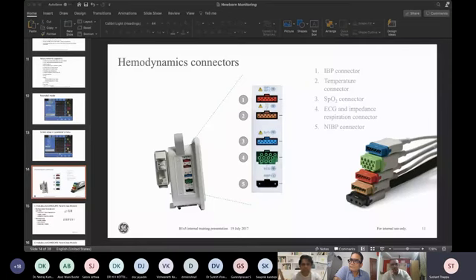I think I can let other people also take this, but I'll take this. GE SpO2 is a proprietary technology again. If you look at Masimo, the focus is on the movement part of it as well. For Philips and GE, for both of them, the focus is more on the accuracy part of it. So that's the difference. And what you see is that the overall fluctuation in terms of SpO2 ranges would be much less with GE and Philips both.